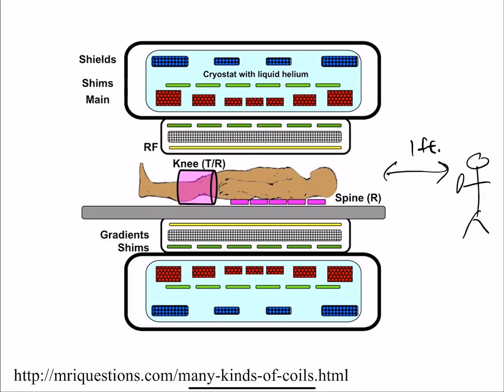So what's going to happen next? How far into the magnet will it go? Let's assume I'm right here at the center of the magnet, along the axis of the magnet. The water bottle is here, and it's ripped out of my hands, so it goes flying into the magnet. How far will it go? Will it go through the magnet and hit the wall, or will it? Yeah, so by conservation of energy, where must it stop? In the center. So one possibility is it stops in the center. What's the other possibility?